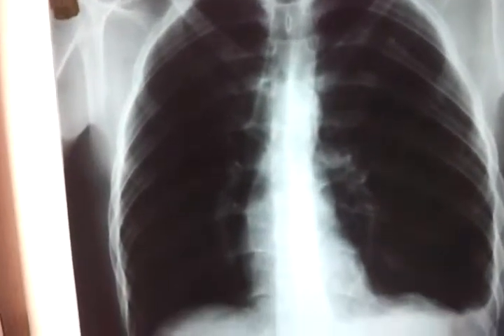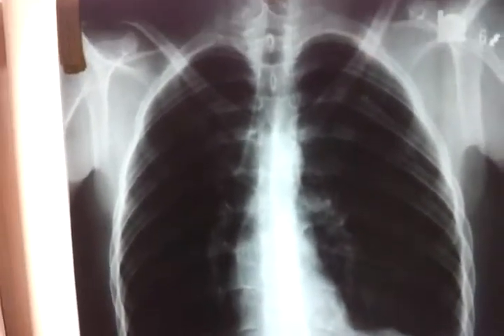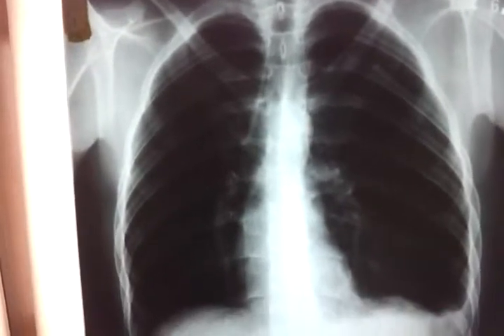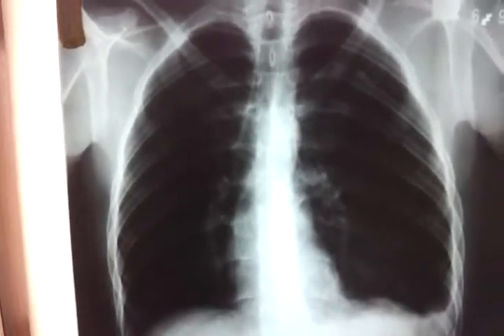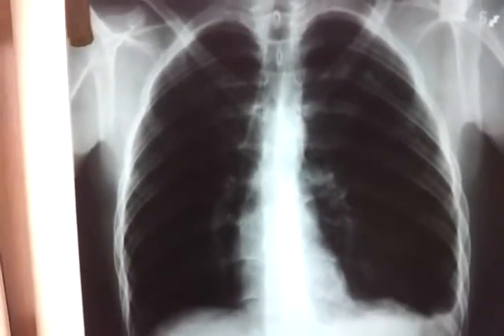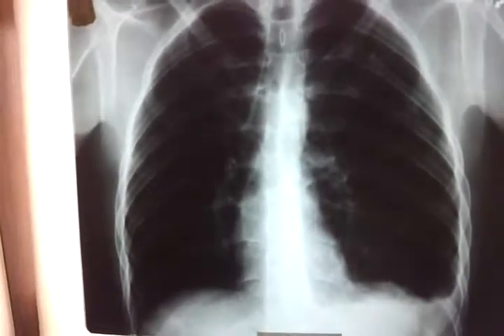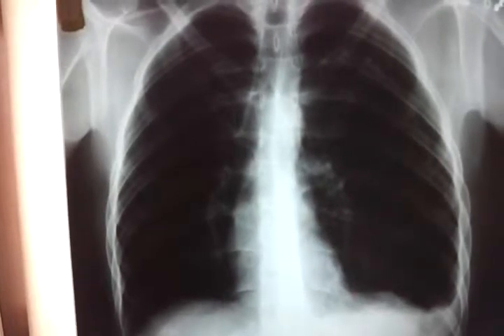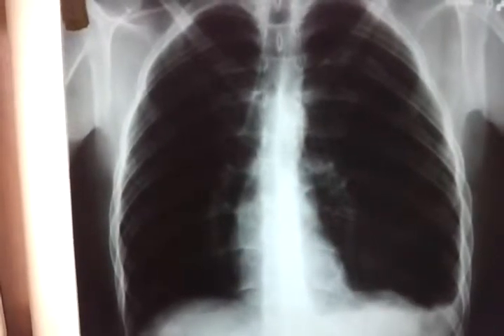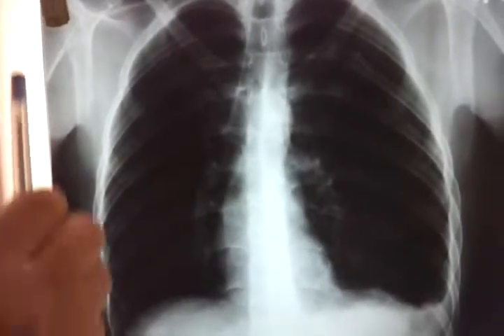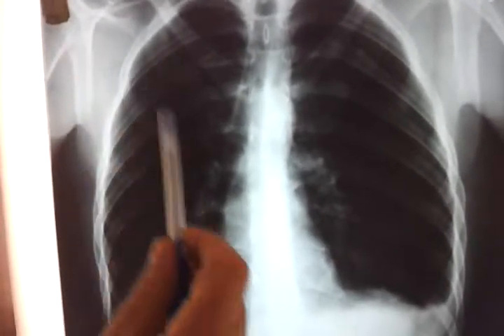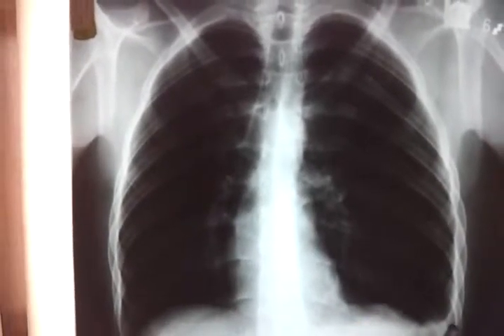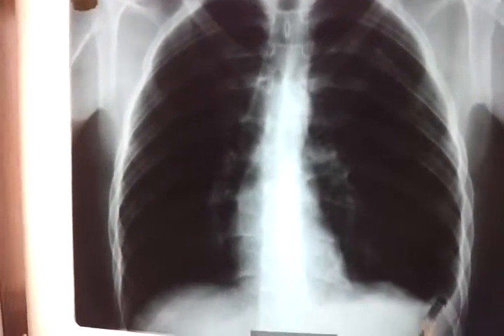What's wrong? There are two ways to start X-ray reading. Either you start systematically, or you go right away to the pathology.